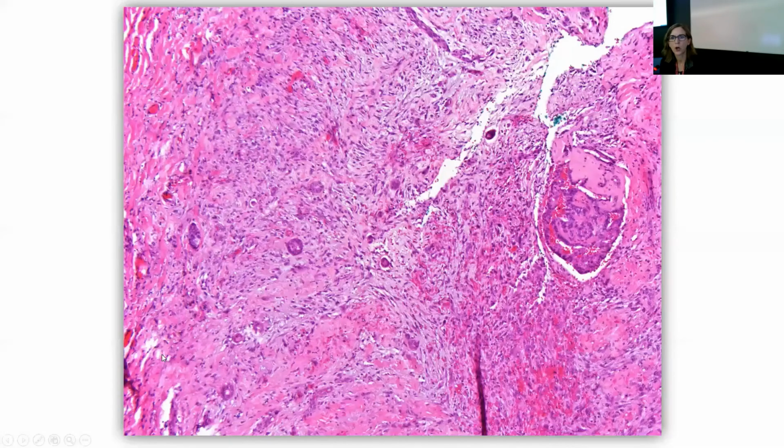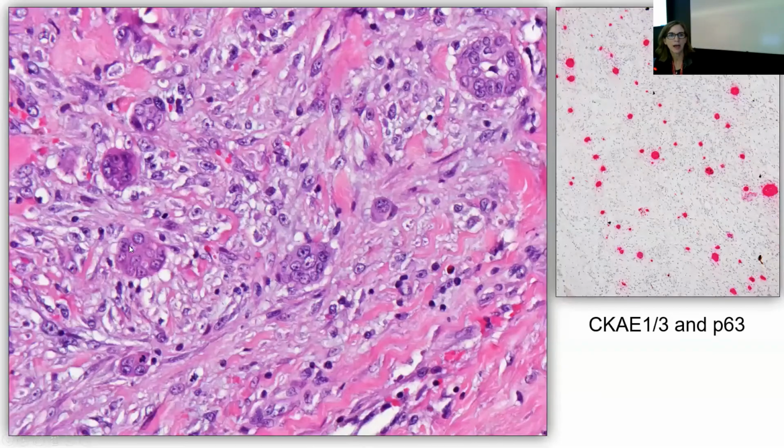So the patient went on to have an excision, and here's the excision. And you can see perhaps some of this sort of papillary benign intraductal papilloma from that area of sclerosis that was in the core biopsy. And you can see all these scattered epithelial elements. Here they are on high power. And I agree, they look pretty alarming.